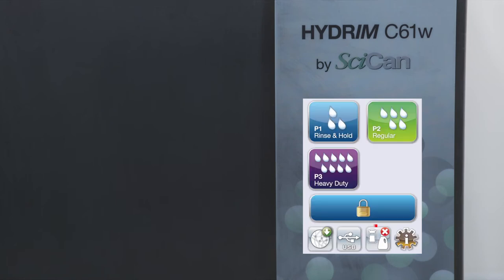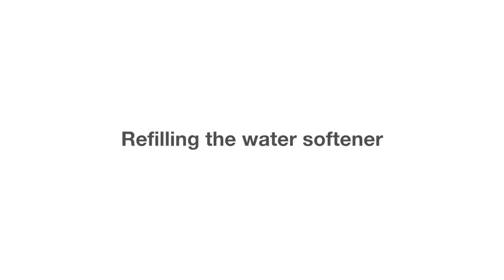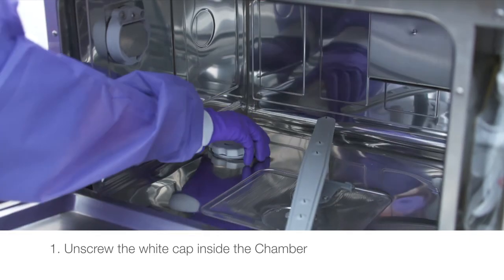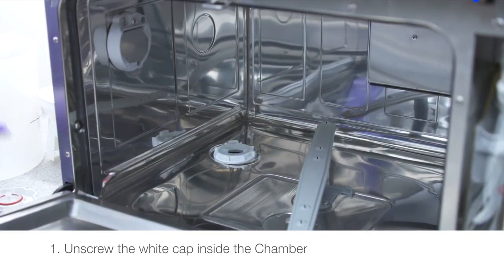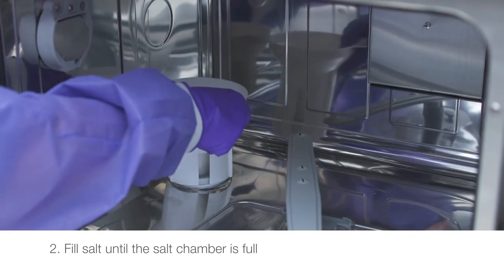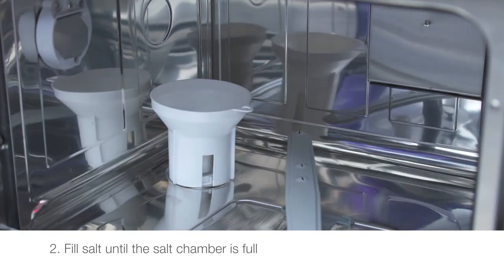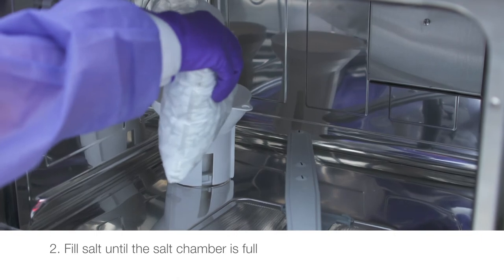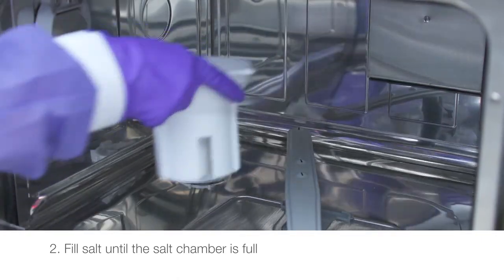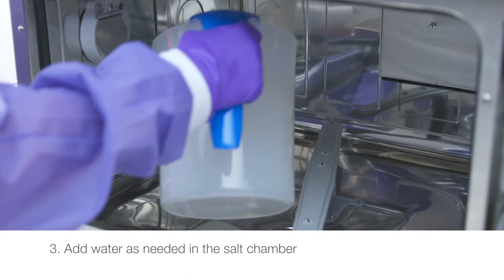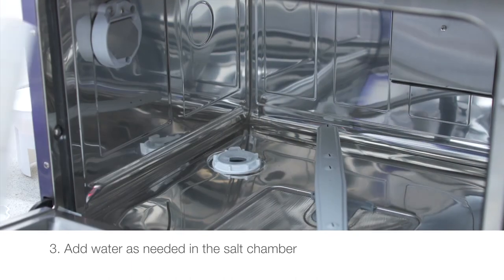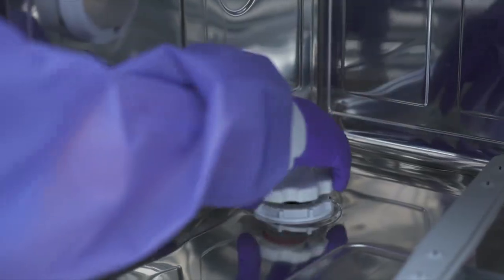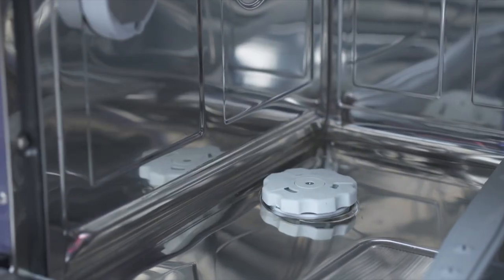If the water softener needs to be refilled, a red X will appear next to it. To refill the water softener, unscrew the white cap inside the chamber. Fill salt until the salt chamber is full. Add water as needed in the salt chamber. Close the salt container lid, ensuring a tight seal.